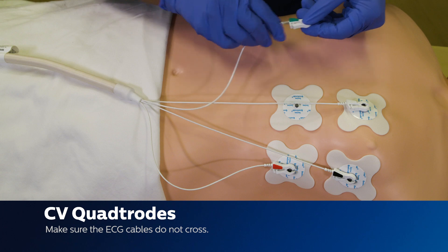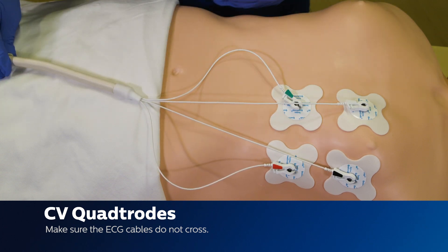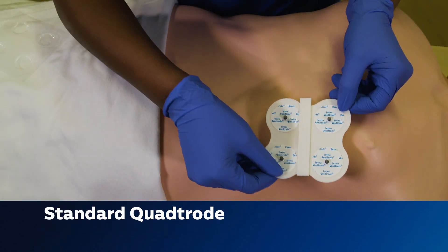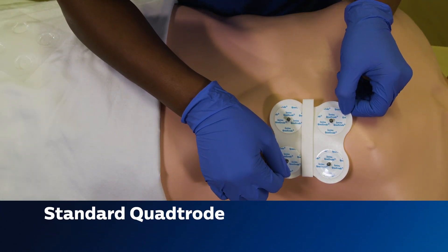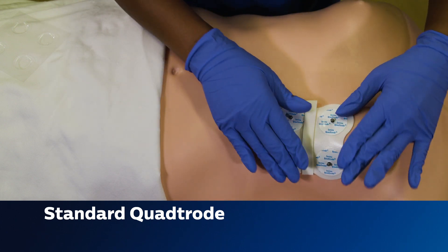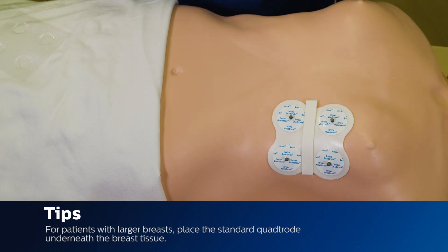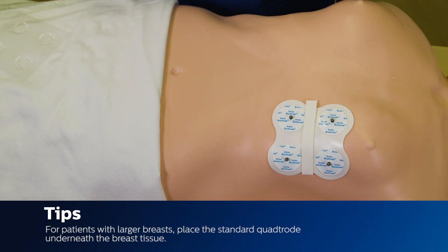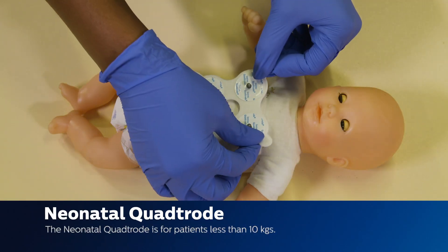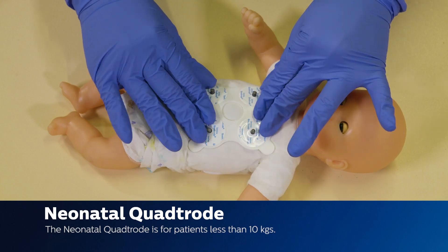After placing the quatrodes, make sure the ECG cables do not cross. When using the standard quatrode, place it below the imaginary nipple line. The patch will be on the left side and not in the center of the chest. For patients with larger breasts, place the standard quatrode underneath the breast tissue. When using the neonatal quatrode, the patch will be placed in the center of the chest.